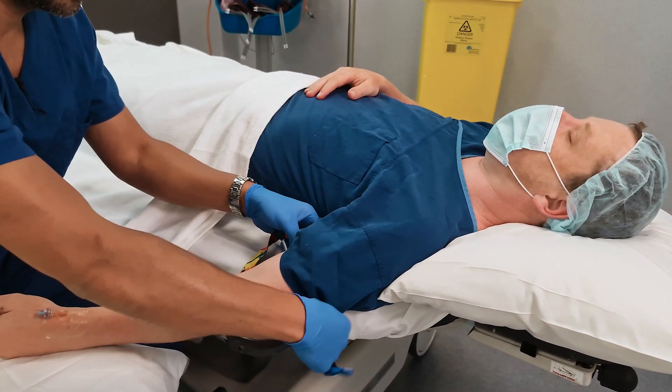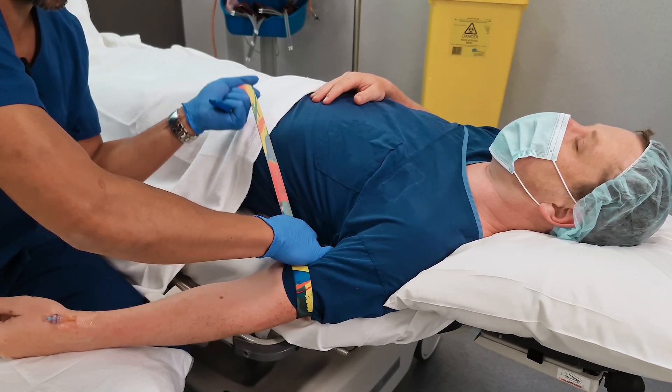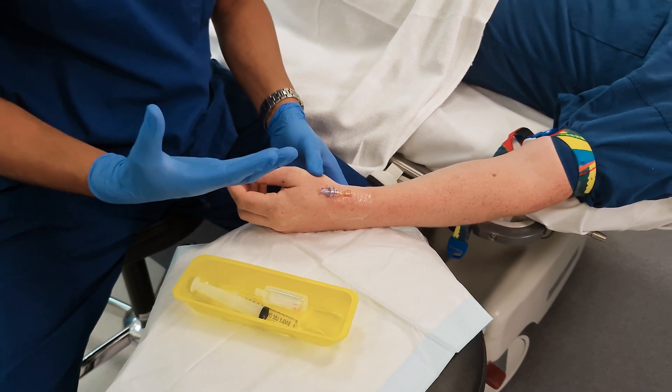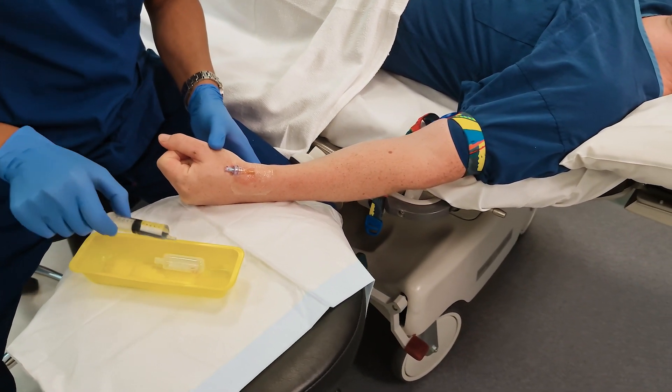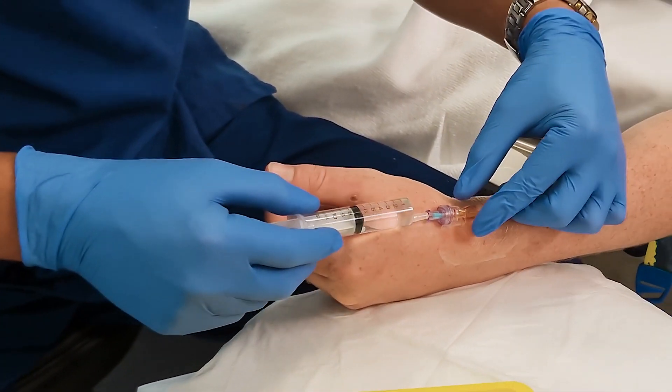You'll also find that you'll be able to aspirate blood if you place a tourniquet on. Get them to squeeze their hand, make a fist — keep doing that over and over again — and you should be able to aspirate blood.